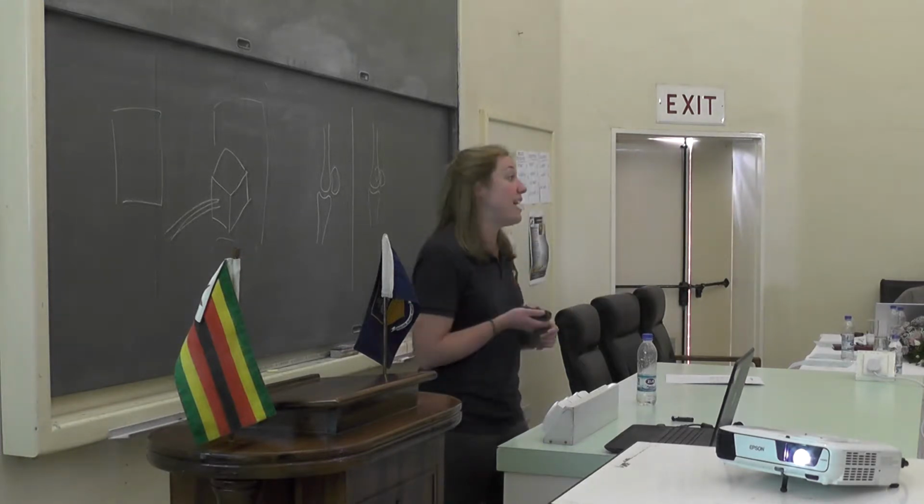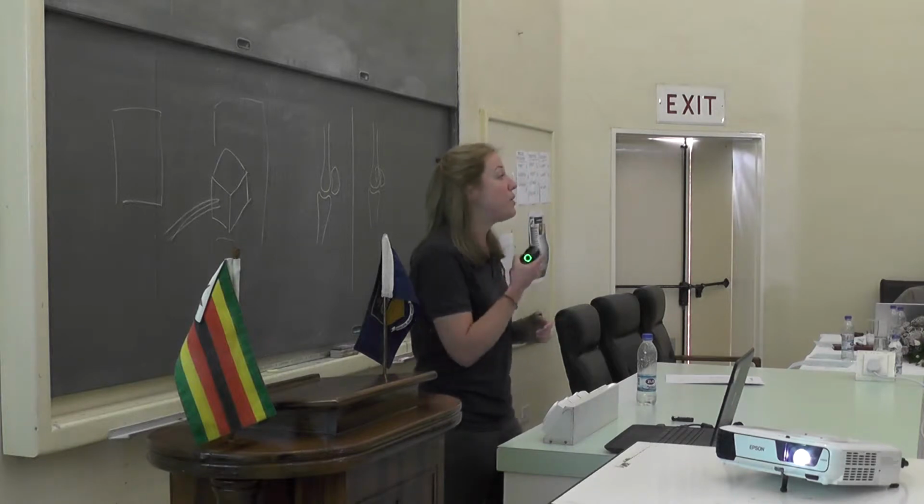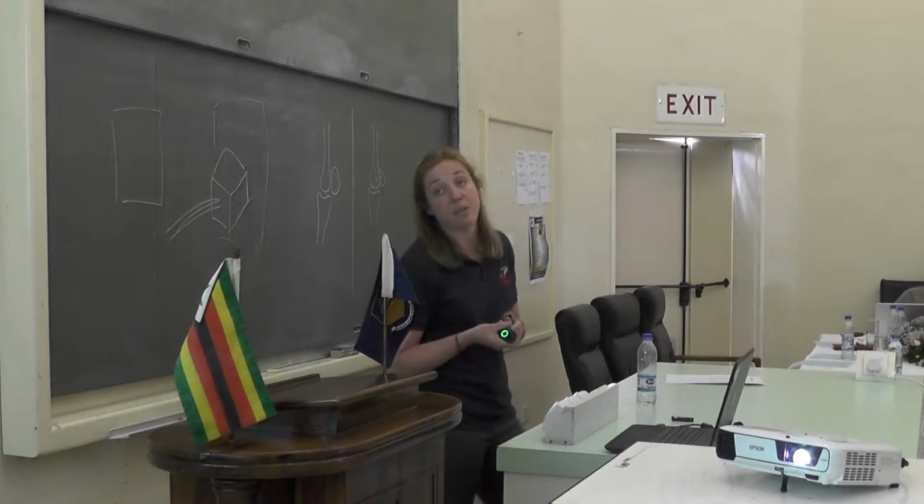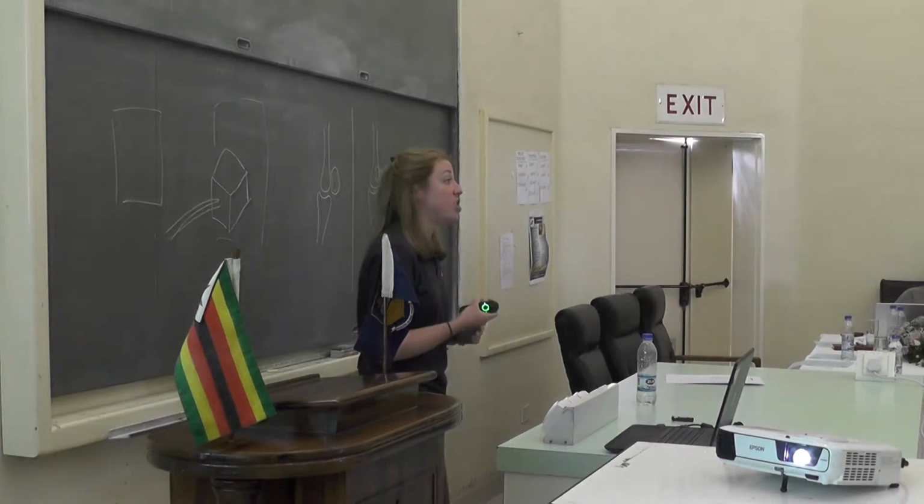Also, if you're trying to image the head, remember, the buckles and all of things of a head collar might sometimes have metal, and that again is going to cast a shadow, so it's going to effectively hide some things. So you need to think of all these baseline things, and then you must prepare your patient.